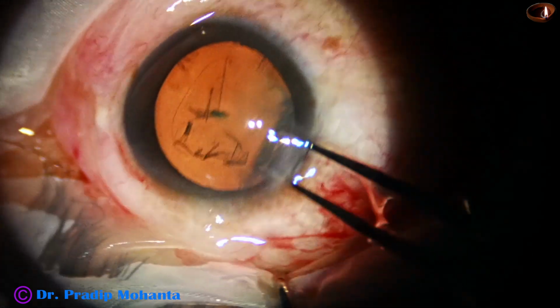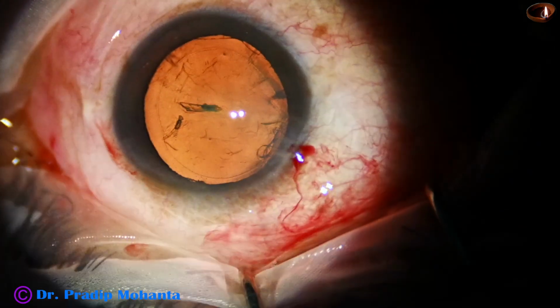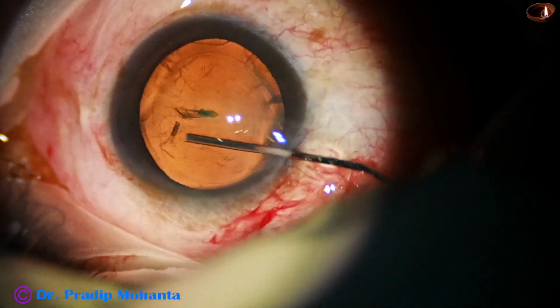The center of the anterior capsule is pierced by the tip of the Utrata. A capsular tag is raised. This capsular tag is guided all around to do the rhexis.